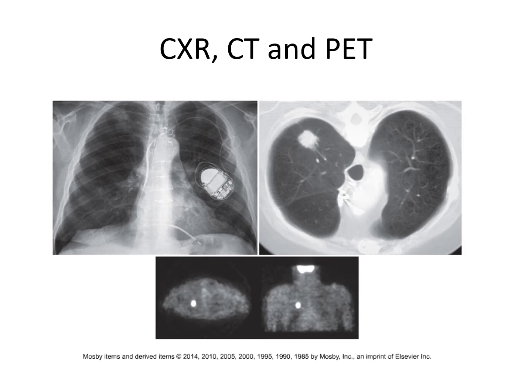Oh, here it is. They have the patients fast, so they don't eat or drink anything, I think, for about 6 hours, and then they give them glucose, which uses a glucose analog attached to a positron emitter.